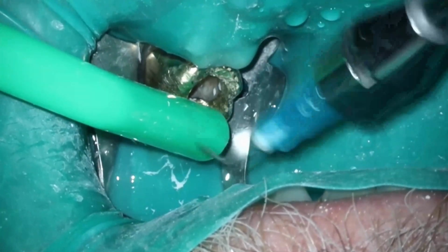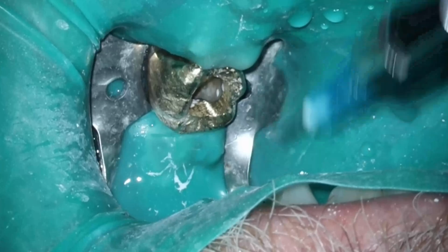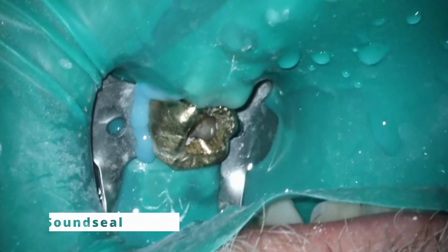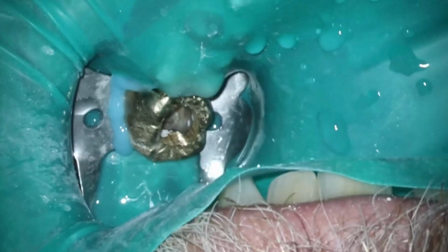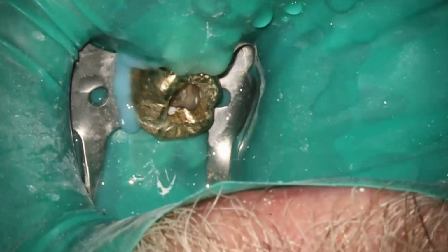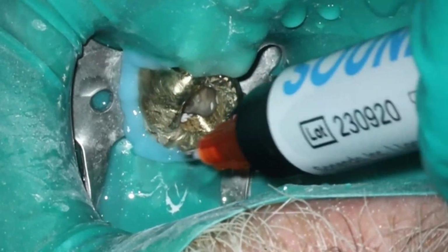I also was a little concerned about that gold crown. You can see the black staining underneath there. One of the cool things about the GentleWave is that if there's leakage under the crown, you're not going to be able to get a good seal. That's the patient's finger. Don't worry. Like you can see, I have gloves on. But the GentleWave is going to dislodge, or it won't get good suction, and the crown usually will pop off during the treatment itself. So that is a normal thing to see here.